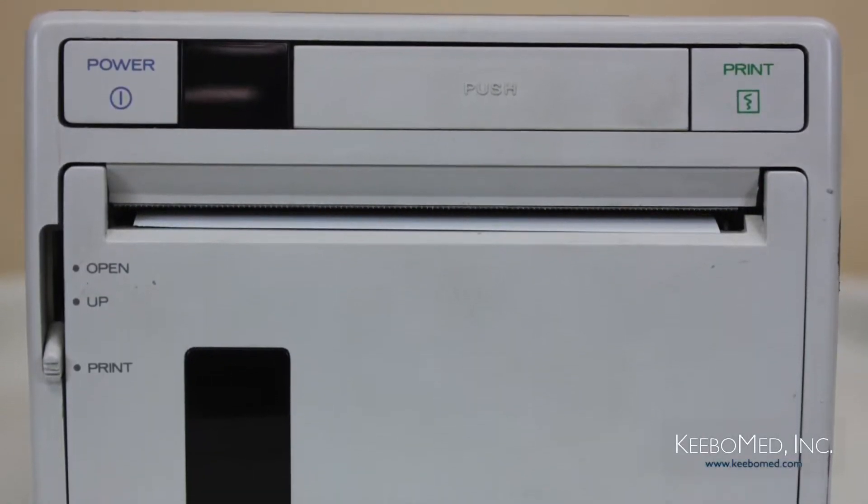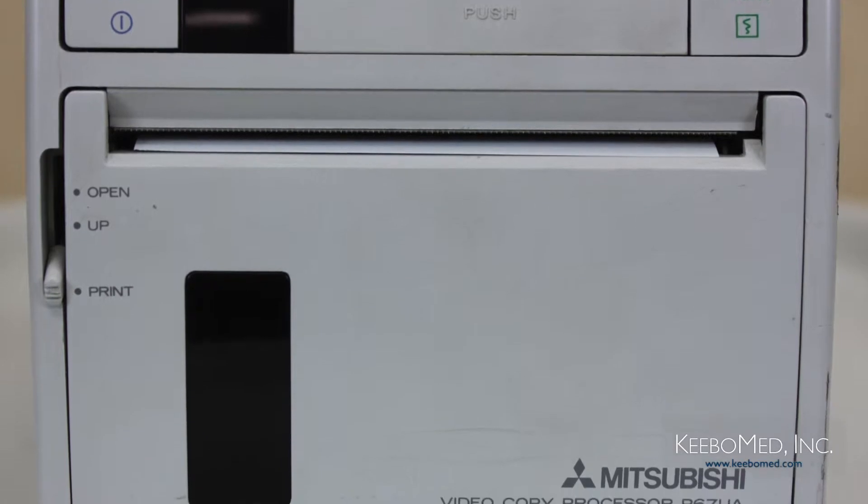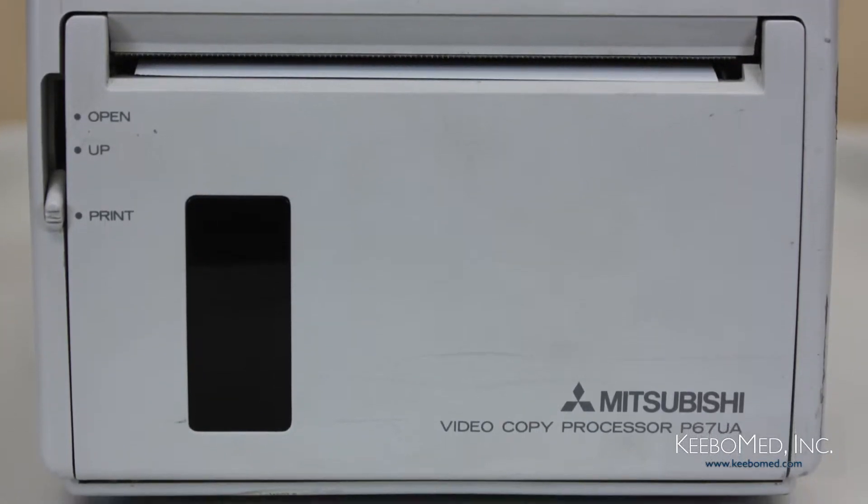We are going to now see how to properly install a video printer to the 8300 by following these simple steps.